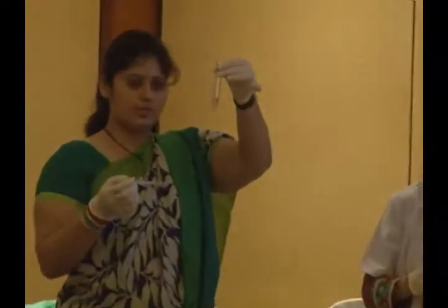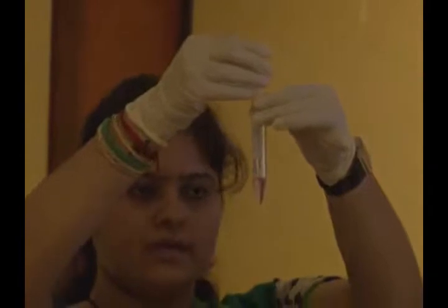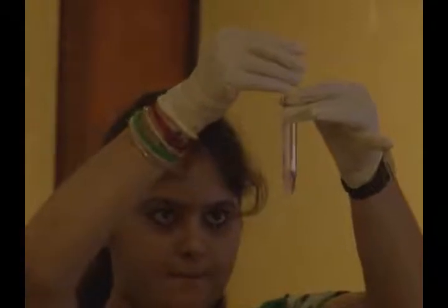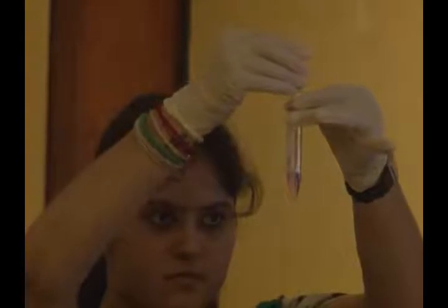then I will take higher density. I have taken the lower density. Now go underneath and slowly release the higher one. Can you please show it on the screen?